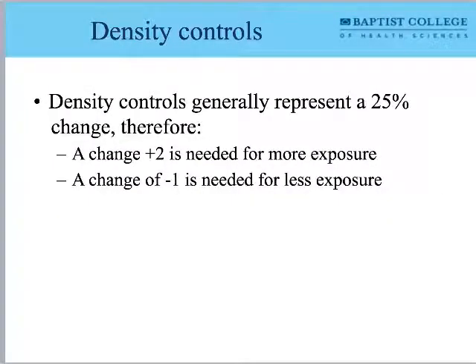All right, the other kind of woolly thing that comes with messing around with automatic exposure controls is to think about density control. But before I jump into this, I want to point one thing out, because there's a major statement that he makes on page 414, and I don't want us to get past this.